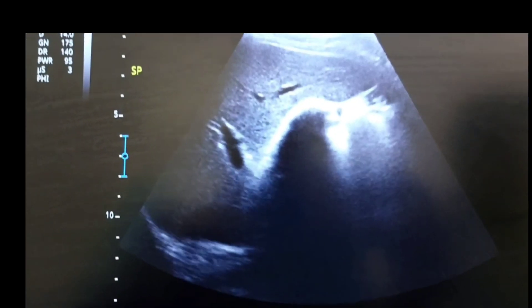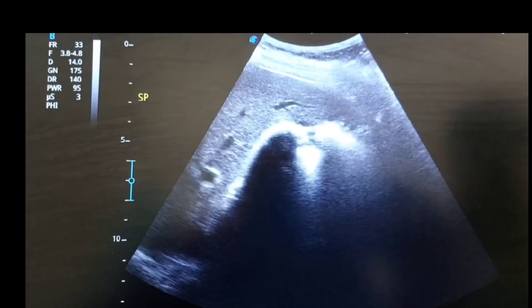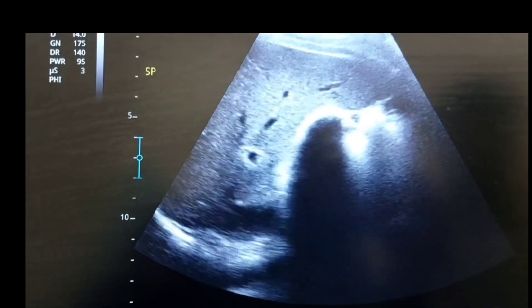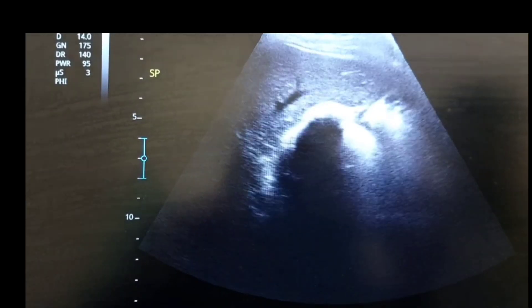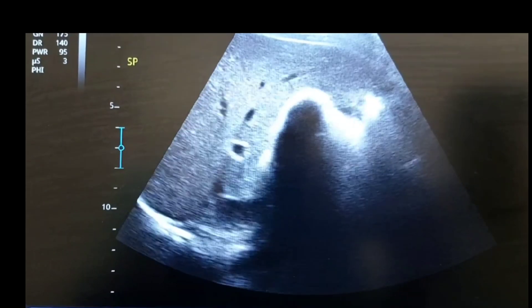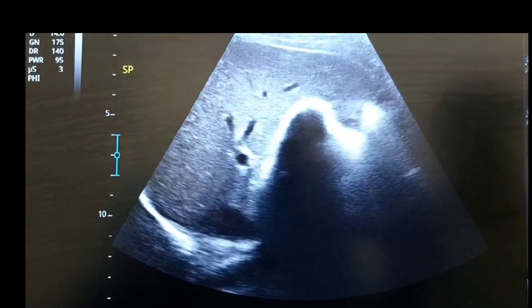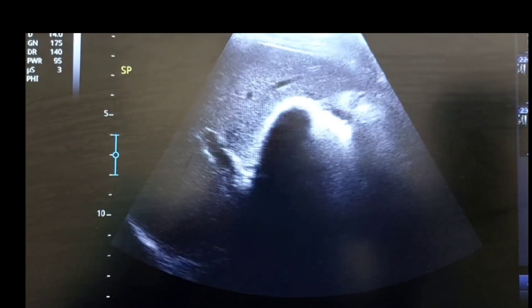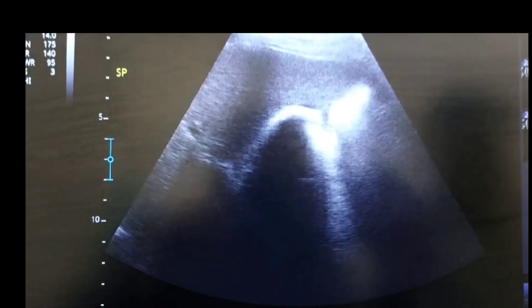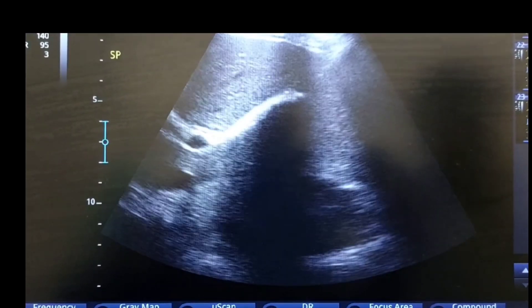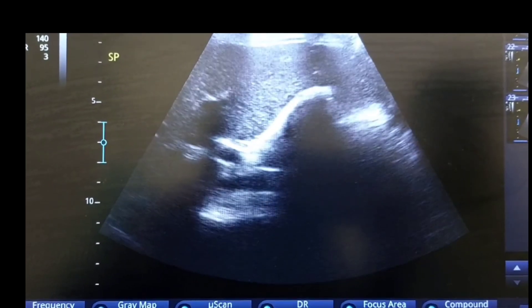When you come across such imaging, you should not confuse it with other differential diagnoses. You might think these are gallstones — they are not. You might think this could be emphysematous cholecystitis — it would not be. You may think it could be pneumobilia — these are not the differentials in this case. This is gallbladder wall calcification, and it would be termed as porcelain gallbladder. In your report, mention this as extensive wall calcification suggestive of porcelain gallbladder.